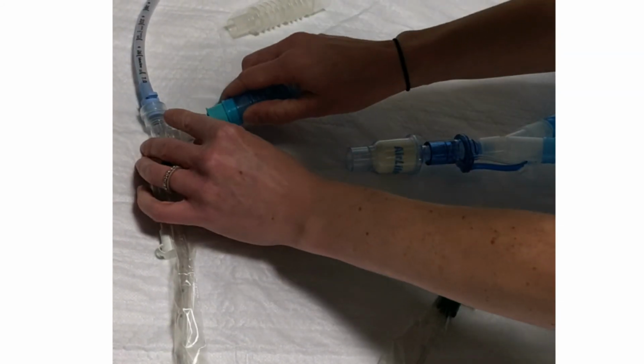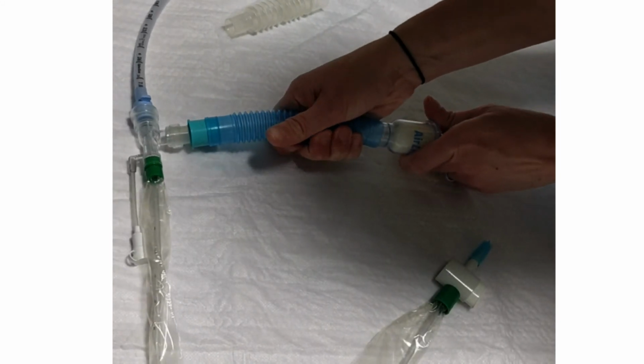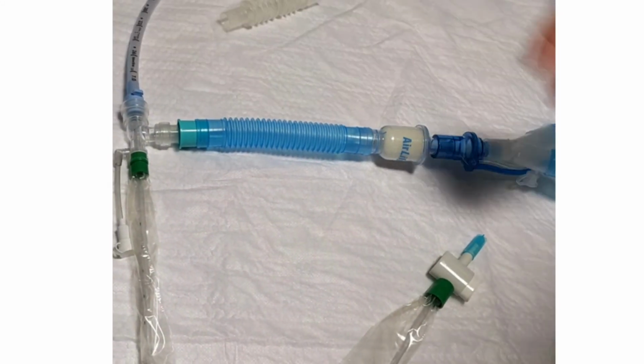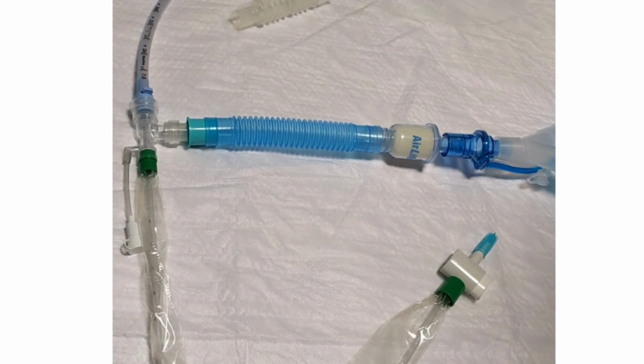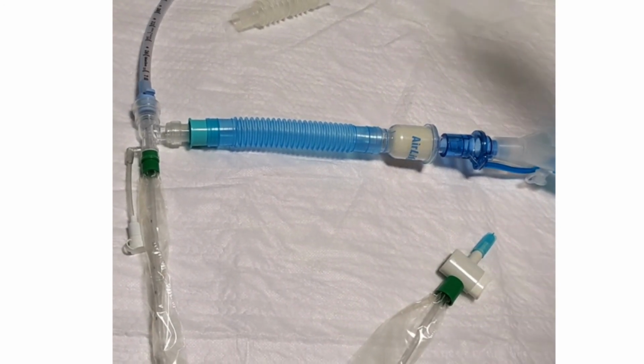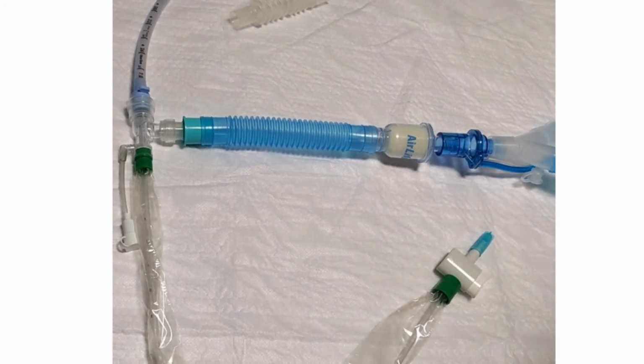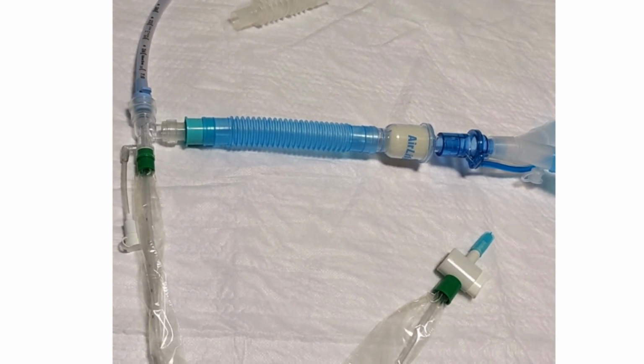You'll notice I always try to remove it on an exhalation, so I'm not taking it off while air is being delivered. You may get some aerosolization or splash up if you do that. So I try to always change it on an exhalation. The other thing you could do, of course, and which we have all our respiratory therapists do, is just pause the vent briefly while you're doing all that switching and changing.